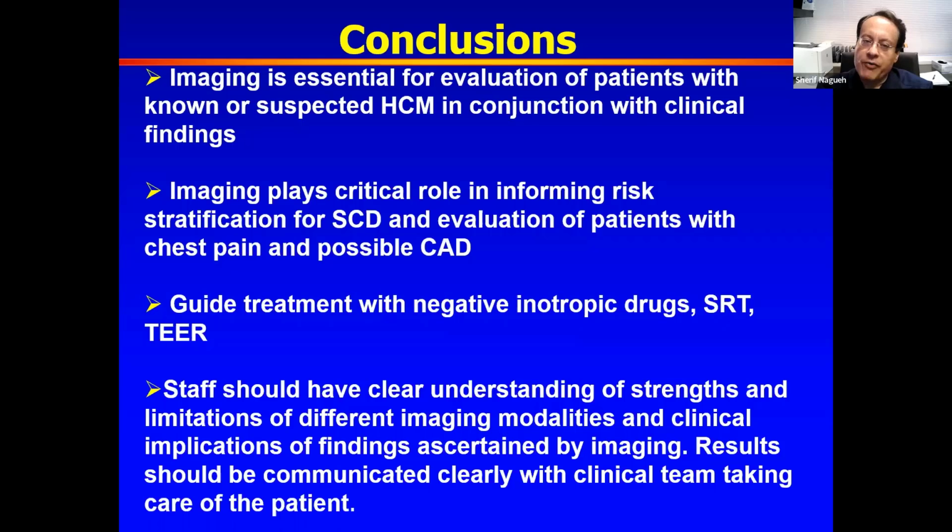To avoid the overmeasurement, if I'm the one scanning, the advice I give to the sonographers is avoid the off-axis cuts or the oblique cuts, because these may result in higher thickness than what the true thickness is. Also combine that with the short axis views so you identify which segment you are measuring in the parasternal long axis and what it looks like in the short axis.